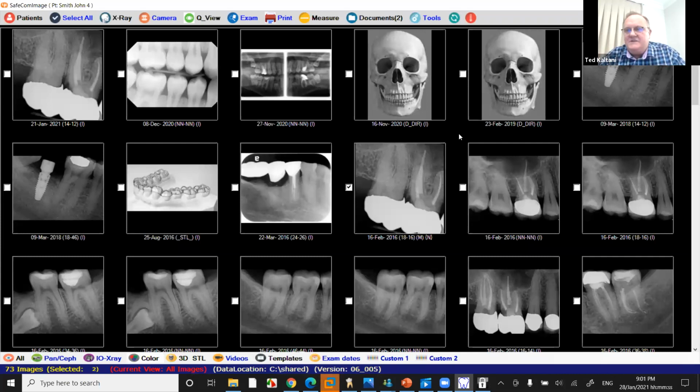Now, those engines are, as I said, black boxes. They're built by third-party big companies. They're built for companies like Henry Schein, for example, or GM that have millions and millions of records, or Google, that you need that kind of power in order to receive the information. When we look at images, an image has probably 5 or 8 attributes, like date, time, tooth number, maybe modification date. Maybe a handful of attributes that you need to save.